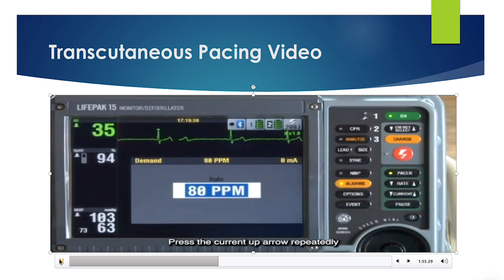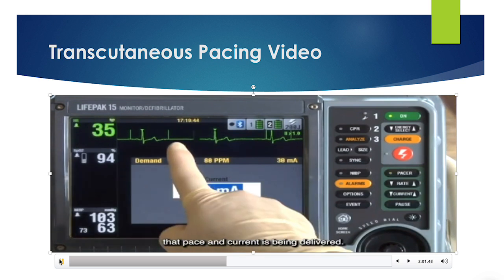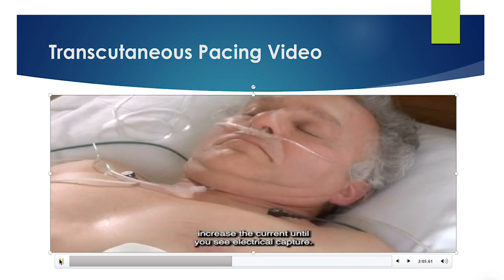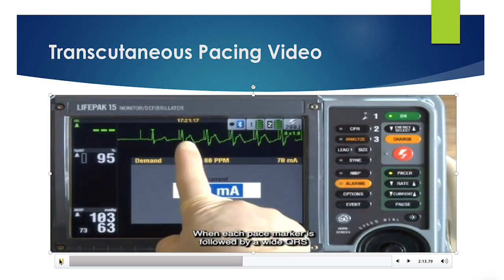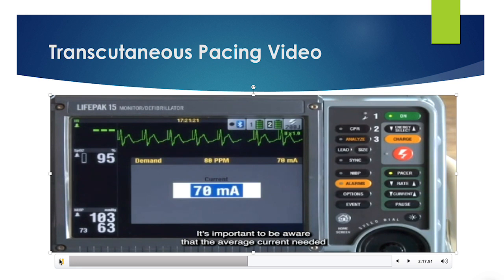Press the current up arrow repeatedly to increase the pacing current. Now you can see these pace markers, indicating that pacing current is being delivered. You should notice the patient beginning to twitch. Increase the current until you see electrical capture. You'll have electrical capture when each pace marker is followed by a wide QRS and a T wave, like this. It's important to be aware that the average current needed for capture is between 50 and 100 milliamps.